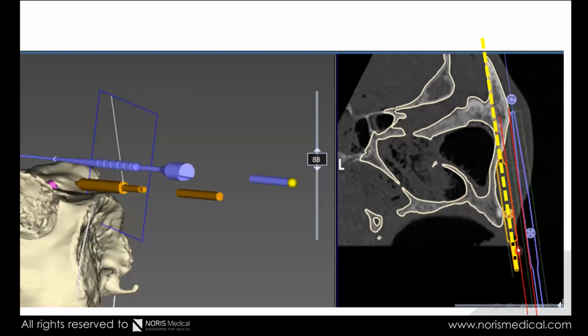If we continue, what we see when we take the diamond and start grooving up to this point, we do that while we groove. While we make the groove, we go further in, we take the tool and we measure the distance. The most important thing for us is to understand, to have this distance, okay?